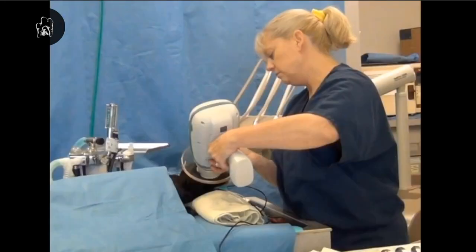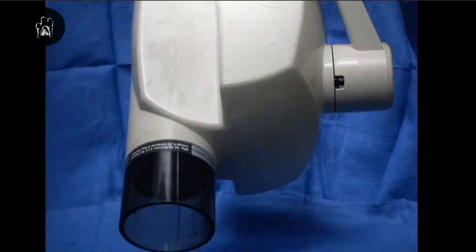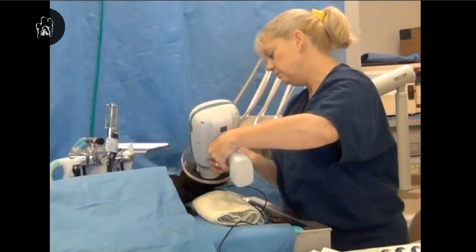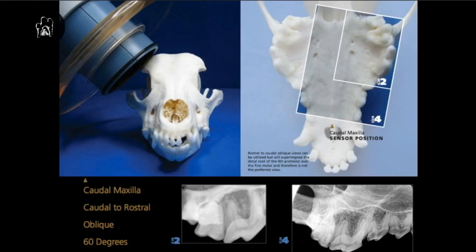She knows that based on where 45 is, and she's giving a reasonable estimate with that handheld versus being pretty much exact if you're using a floor mount or wall mount generator like most of us have. So she would be doing the caudal to rostral oblique method here with the tube head at that angulation, with the sensor where you see it, and shooting at 60 degrees. Those radiographs at the bottom demonstrate what it's supposed to look like if you do that correctly on size 2 sensors, which is what most of us have, or on a size 4 sensor if you have a CR unit.